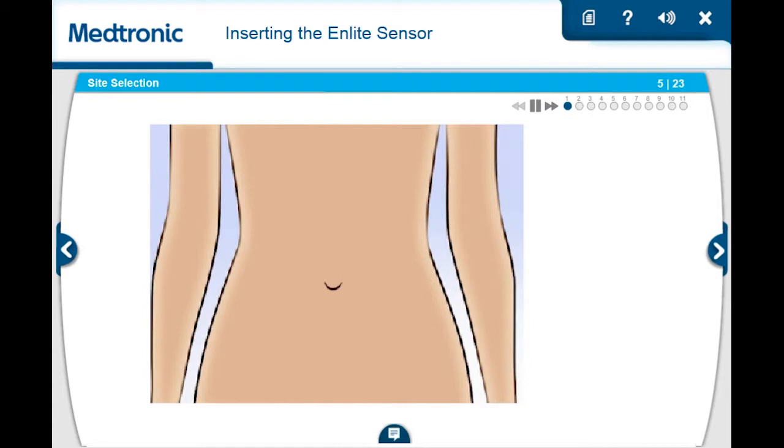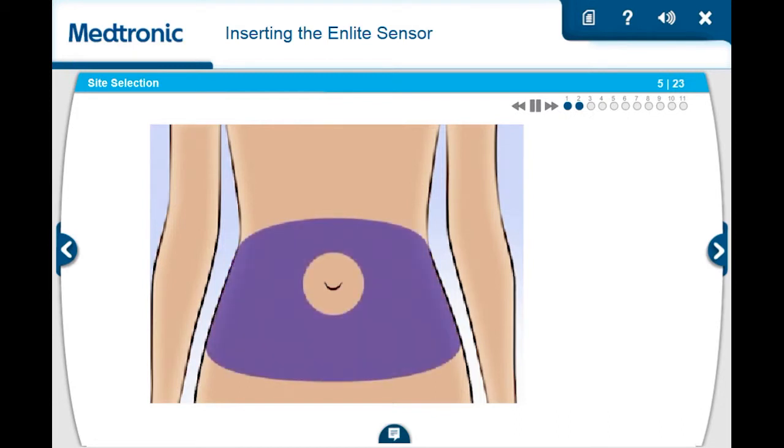Next, you will need to choose a site to insert the sensor. You should choose a place on your body that has adequate fatty tissue, and is at least 2 inches from your navel, 1 inch from your insulin pump infusion site, and is 1 inch away from any manual insulin injection site you may have used.